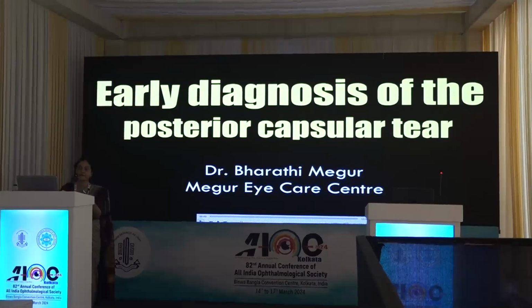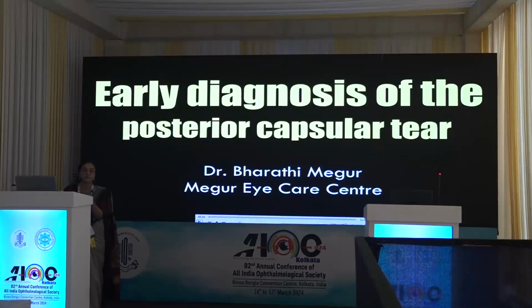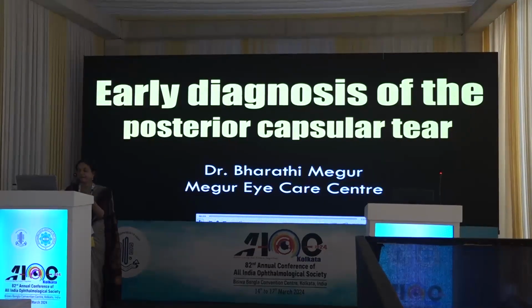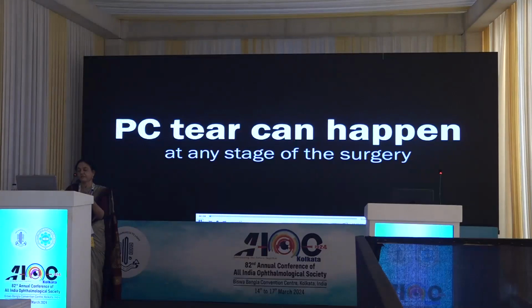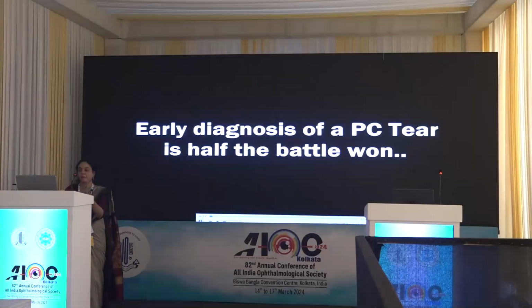Diagnosis of the posterior capsular tear. Inevitably, as cataract surgeons, all of us are bound to experience posterior capsular tear, and let me share with you some of the tips on how to diagnose early. It can happen during any stage of cataract surgery. So, when to suspect a PC tear with an overlying nucleus?